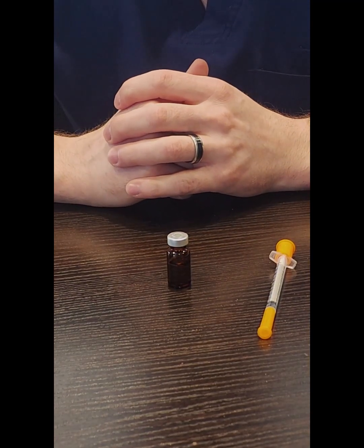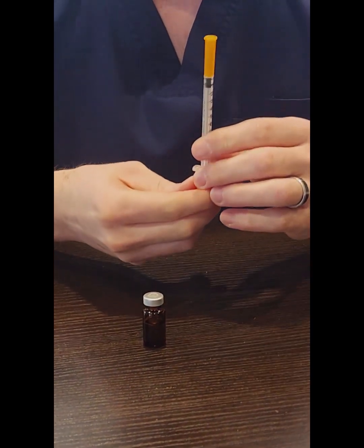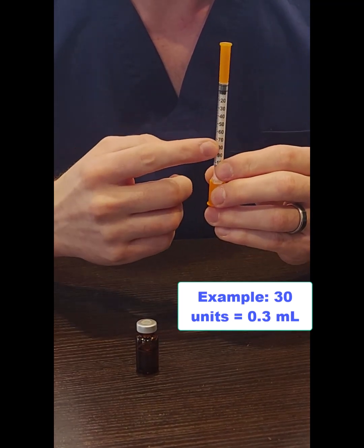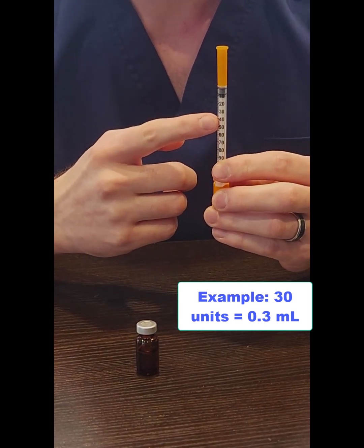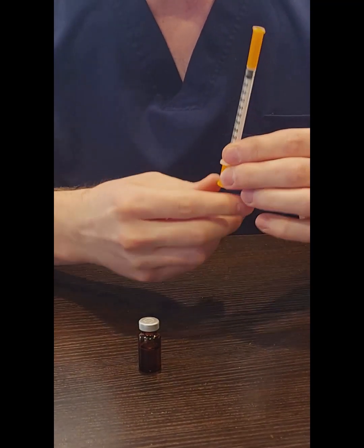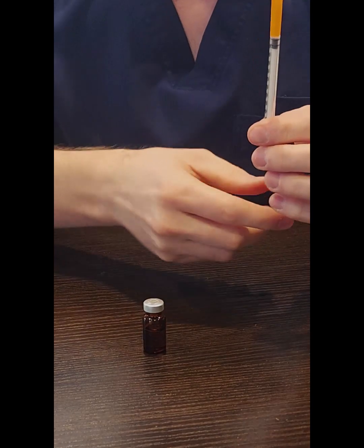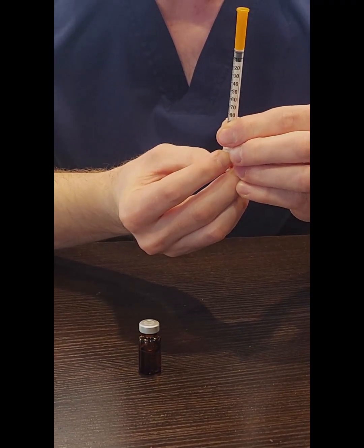While we're waiting for the alcohol to dry, we can go ahead and prepare our syringe. Please be aware that the syringes are labeled in units, and a unit is not the same thing as a milliliter. So the numbers on the barrel of the syringe — for example, 30 — this is showing 30 units, which would be equal to 0.3 milliliters. Once the alcohol is dry, remove the larger orange cap to expose the plunger inside the barrel of the syringe. The first thing you want to do is pull down on the plunger to the same dose that you're going to draw.